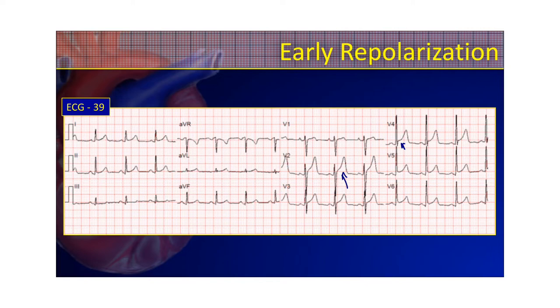We see the ST elevation in these precordial leads, and it's all concave, which is usually not bad. You can identify that it's concave by drawing that straight line from the J-point to the top of the T-wave — sure enough, the ST segment is below that. Looking further, you see the pattern over here in the inferior leads as well — that same concave ST elevation. You might also be able to identify a little bit of notching of that J-point. And all that is because it's early repolarization.